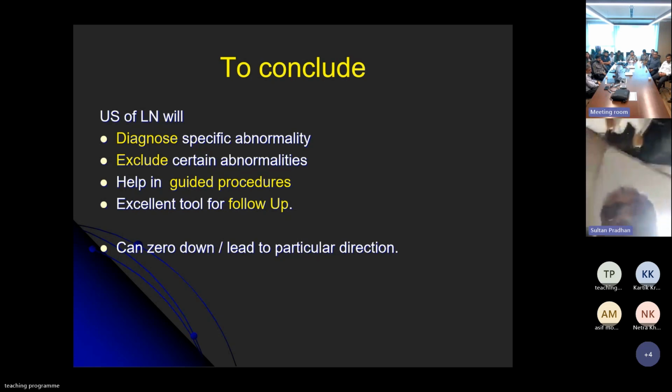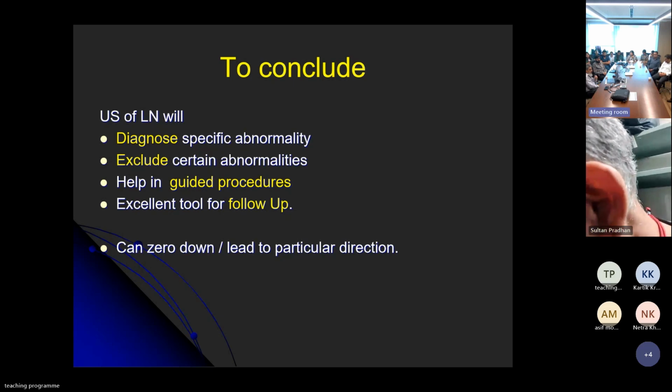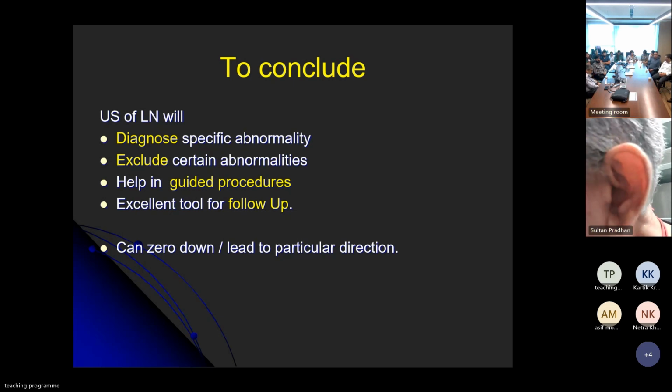I want to ask you about these retropharyngeal nodes. I believe you're doing the oral ultrasounds now. Yes, sir, that is used. Aditi was telling me it's intracavitary. Can you also do hypopharyngeal ultrasound and see these retropharyngeal nodes?